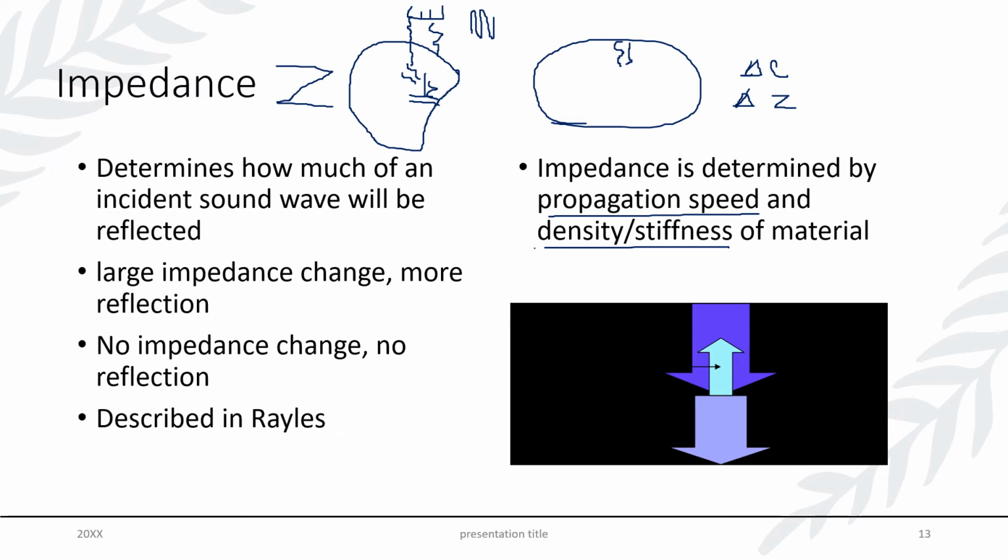It would probably reflect something back because it does have a change in impedance, but because the change in impedance was mild, it would not come back with the same kind of intensity that the echo from the portal vein came with. Therefore, when we look at these two items on an image, my portal vein would be very bright because of that significant change in impedance, whereas my fatty infiltrate would be a subtle echogenicity or subtle brightness because it was a more moderate change in impedance.